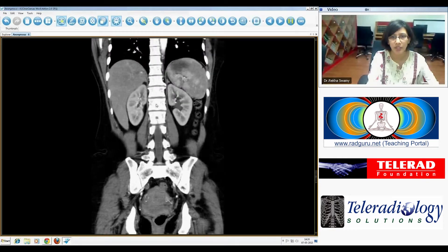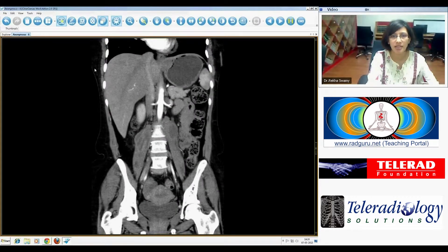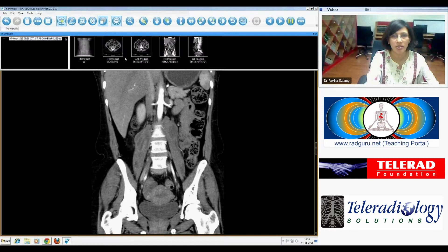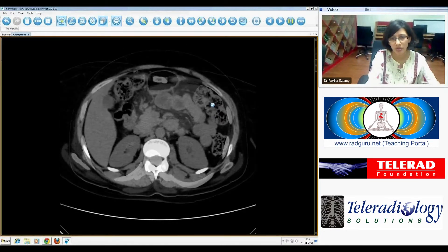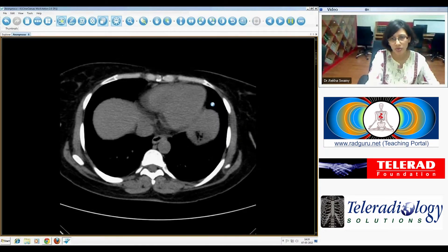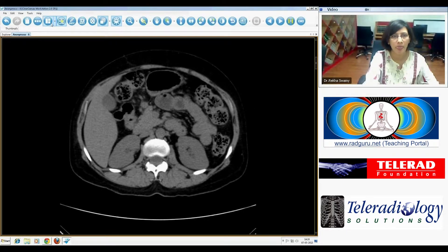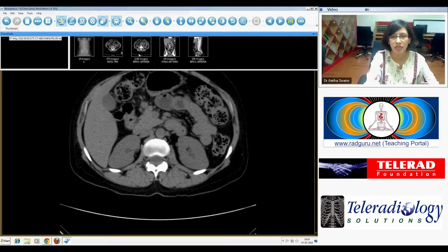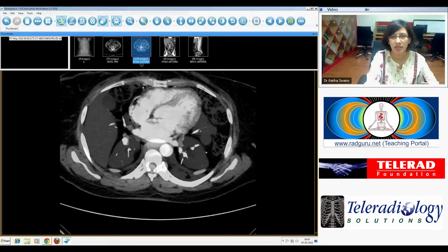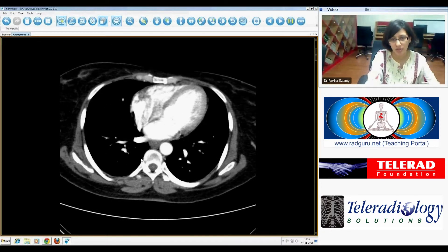Going back to this lesion within the liver — we saw some nodular enhancement in the arterial phase. Looking back at the non-contrast examination, we can barely see it. This is most likely a hemangioma given the nodular peripheral enhancement.